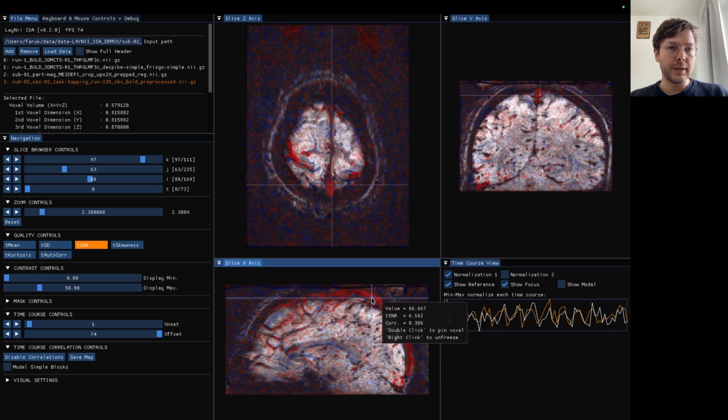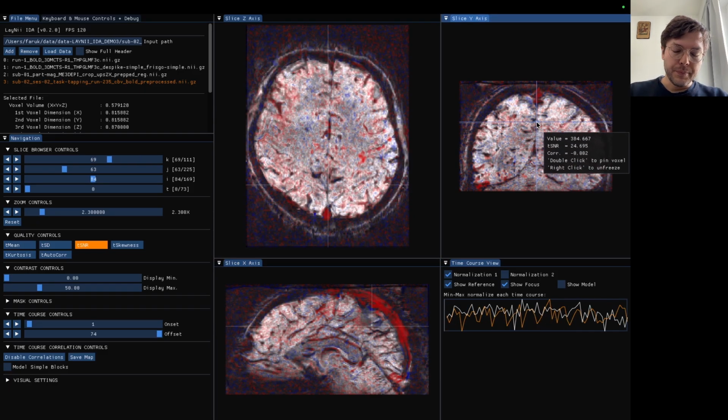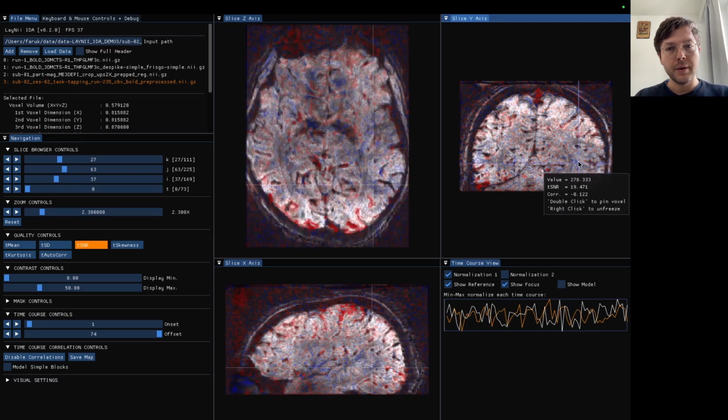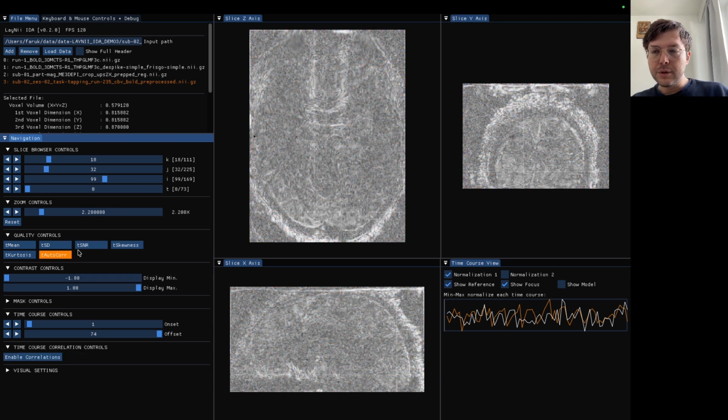So this also can give you some insight with regards to how these quality assurance metrics, being high or low in different metrics, can play along with the strong regional correlations that you are observing or some task activity that you are observing.